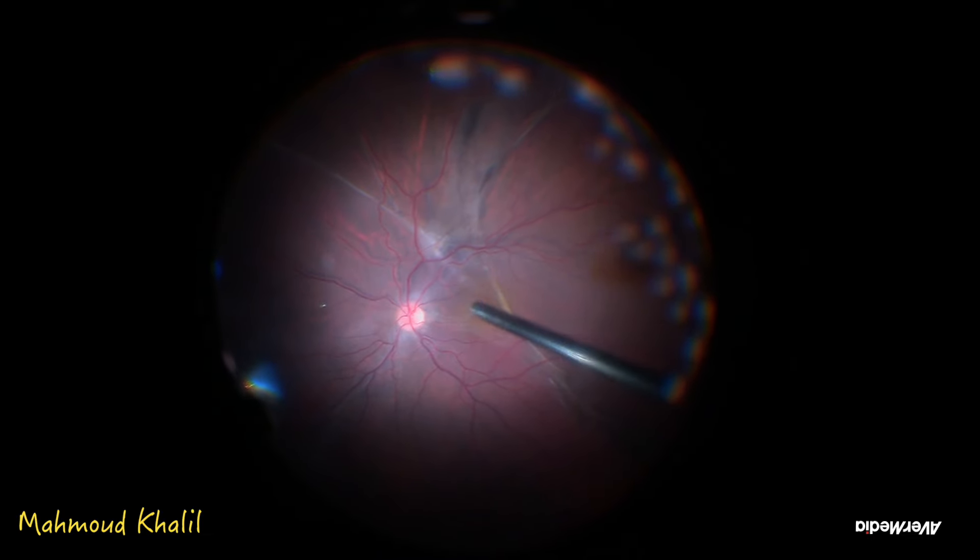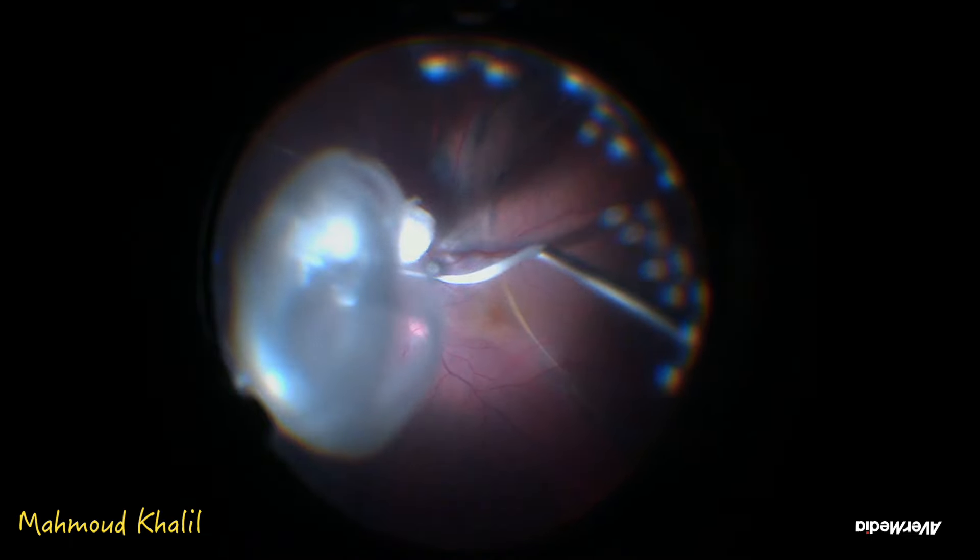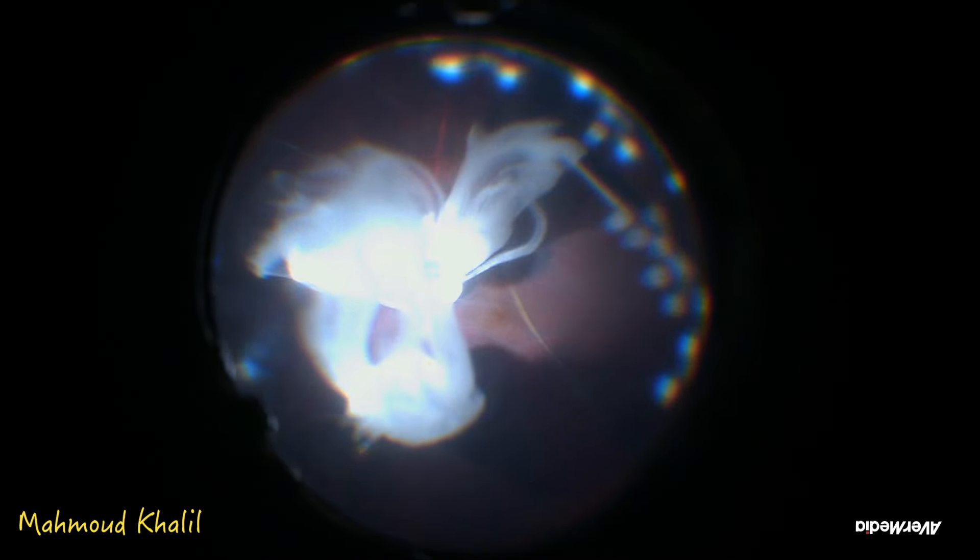Welcome everybody. The case today is a 15-year-old male patient who was presented with old retinal detachment with multiple subretinal bands.